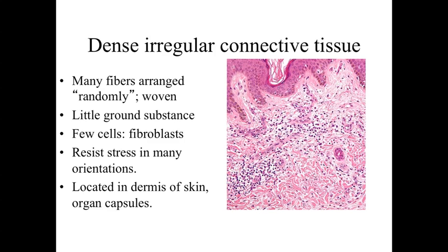There's less of the ground substance, which may sound a little weird, but we're not going to have as many of the glycosaminoglycans and proteoglycans to draw fluids in. But what we're going to see is what appears to be a random arrangement of these denser, coarser collagen bundles, these coarser pink structures weaving in and out throughout the tissue. You can see that on the image on the right-hand side of the slide, at the bottom portion. You can see that coarseness. These are thick collagen bundles.